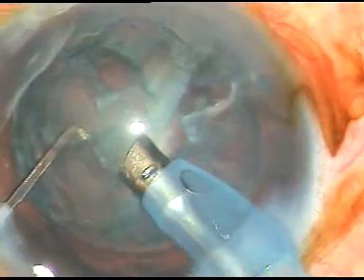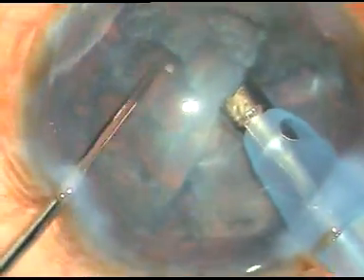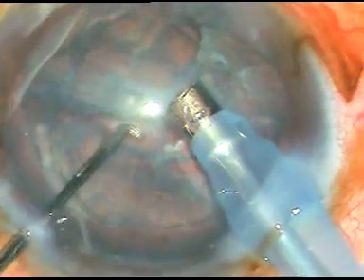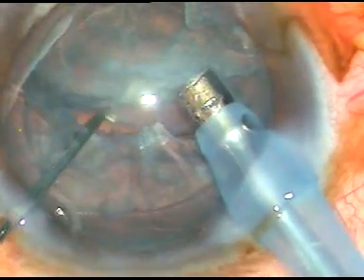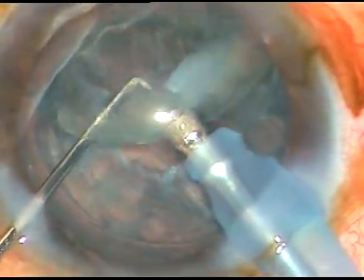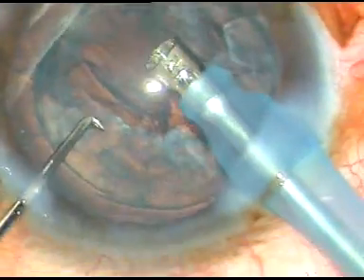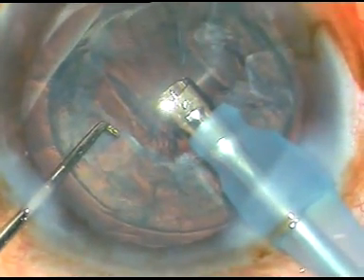Now as I try to get hold of it, I find that the bag is... Now what I am going to do is I am going behind this fragment and going to engage it from below, and then I am going to emulsify this. And now I must not go to the 5 o'clock.